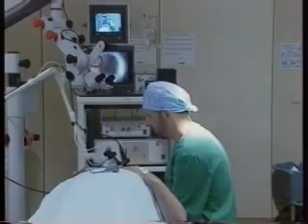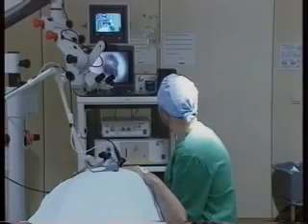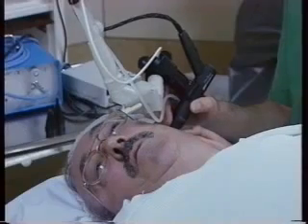The OtoLAM is designed in such a way that the video camera and the CO2 beams are focused on the same plane. In other words, when the image is sharp on the TV monitor, the laser beam is precisely focused. The surgeons therefore have to learn to manipulate the handpiece in the external ear canal using an appropriately sized otoscope.